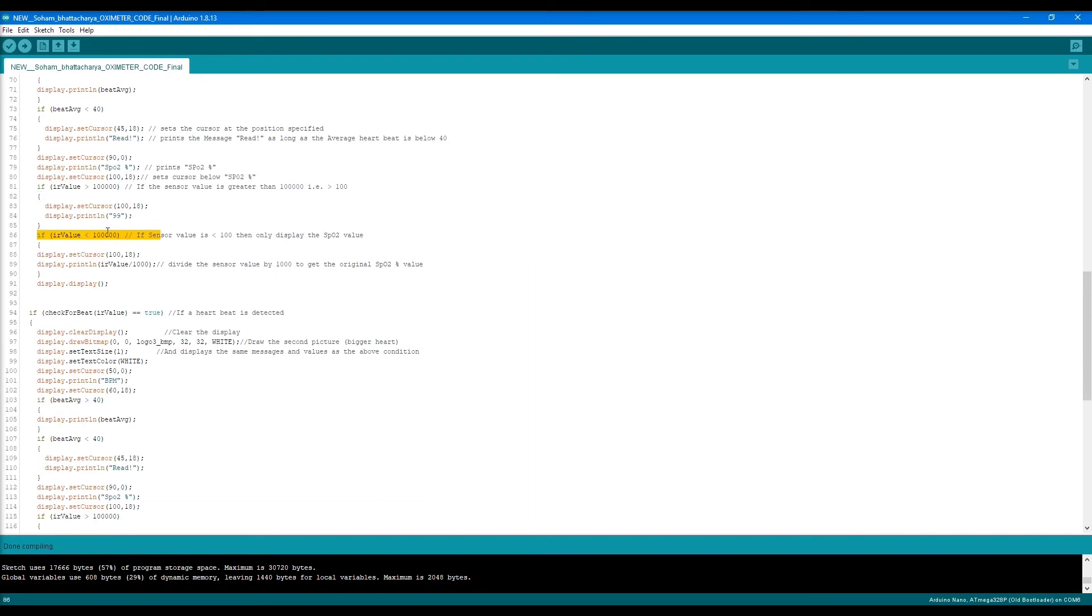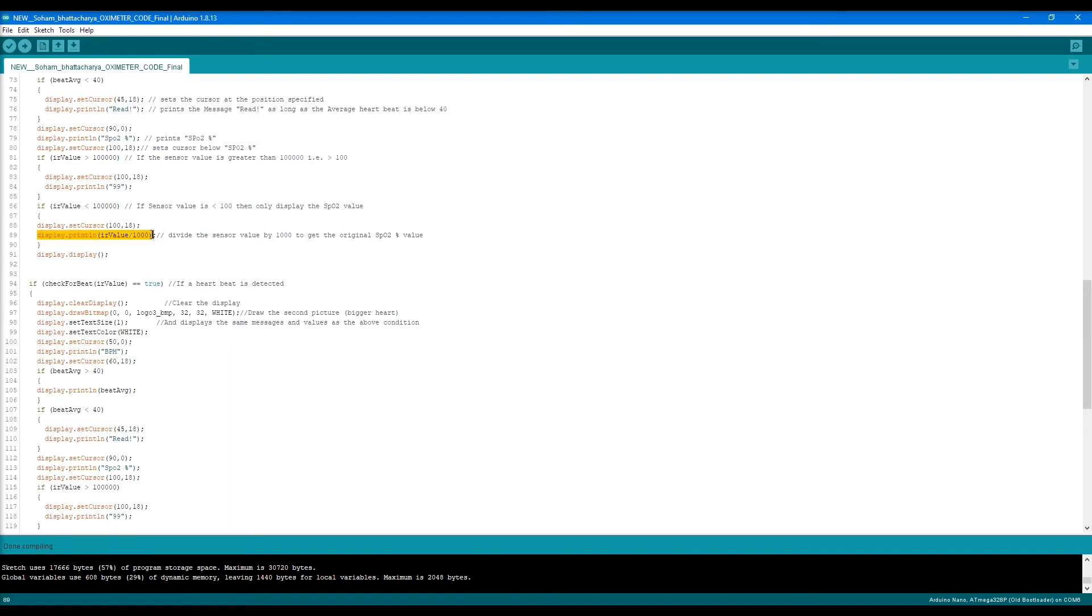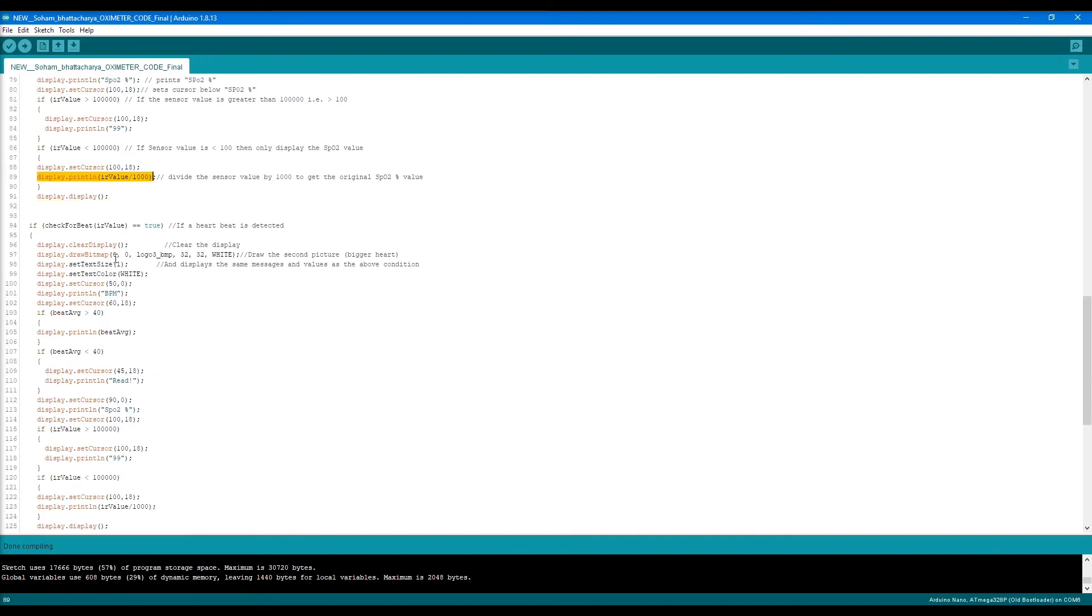Another if condition: if the IR value is less than 100,000, then we print the IR value divided by 1,000. If we divide by 1,000, it gives us hundreds. If it's 99,000, it gives 99. That's why I divided by 1,000 to give the percentage value we're accustomed with.